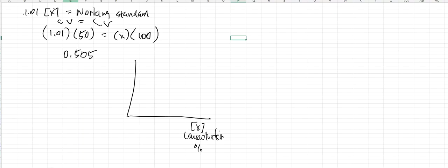All right. And then up until this point, most of the time when you did calibration curves, if you've done those in other classes, your signals would go here on the y-axis. Those signals are called signals because they're from the reports, they're from the machine. In this particular case, this is actually the area, because that's the signal that the machine is seeing. It's calculating areas under those peaks. Area is what's reported on the report down there in that table. So therefore, area is the raw number that gets plotted on the y-axis.